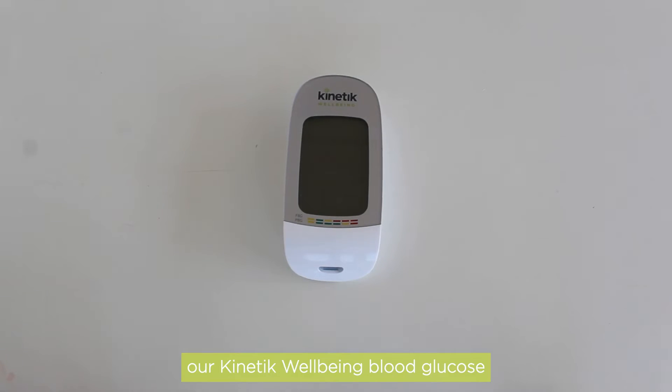Welcome to the demo video for our Kinetic Wellbeing blood glucose monitoring system. Here we will talk through three common troubleshoot solutions.